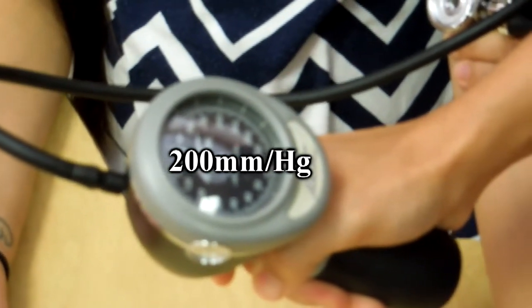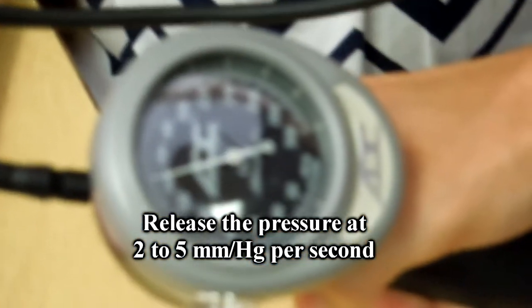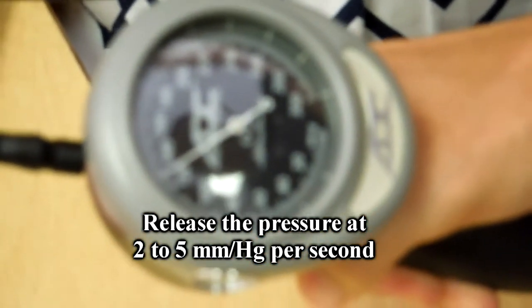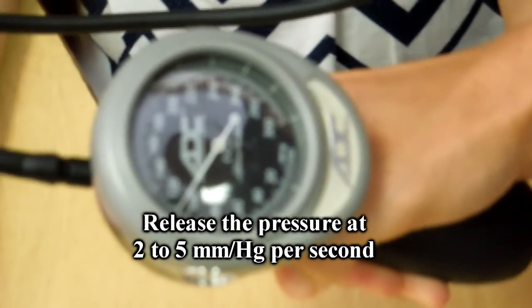Release the pressure slowly at a rate of 2 to 5 mmHg per second by turning the inflation bulb to the left. Carefully monitor the aneroid manometer.